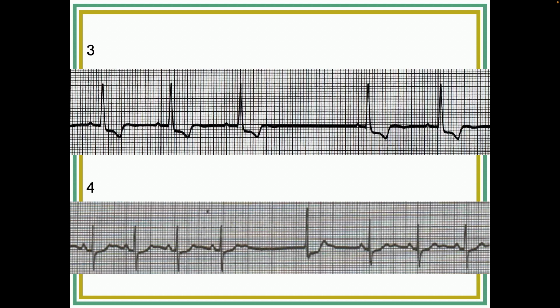On some of these, I've cut off the 6-second marks, and my apologies for that. But you can always come in about 2 blocks and say, that's about where the 6 seconds are. Okay, got that? Now, in this particular case, I think it would be very reasonable to use the 6-second because I would go 10, 20, and then if I did my calipers here, I'd realize it was about twice.